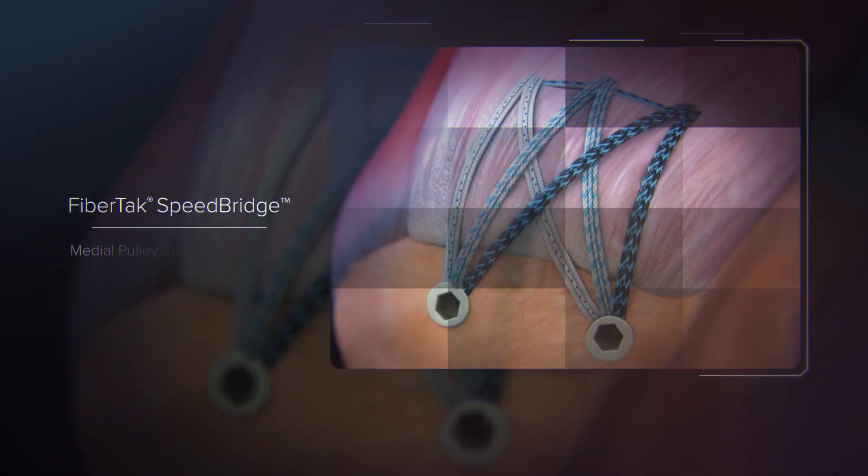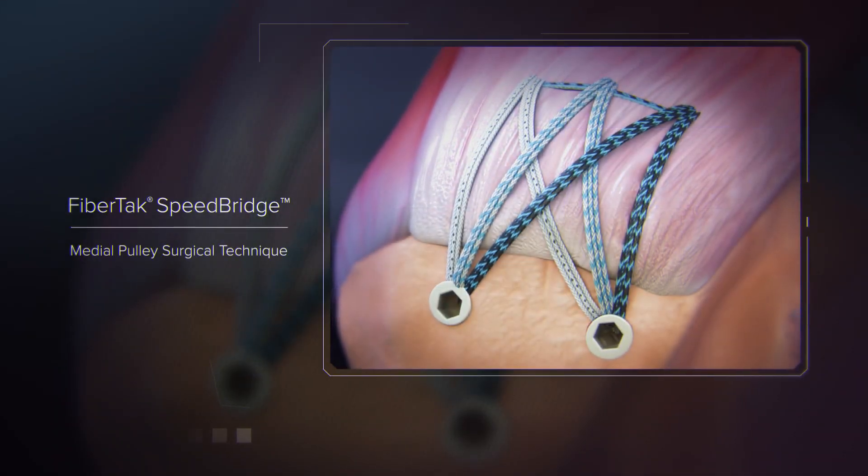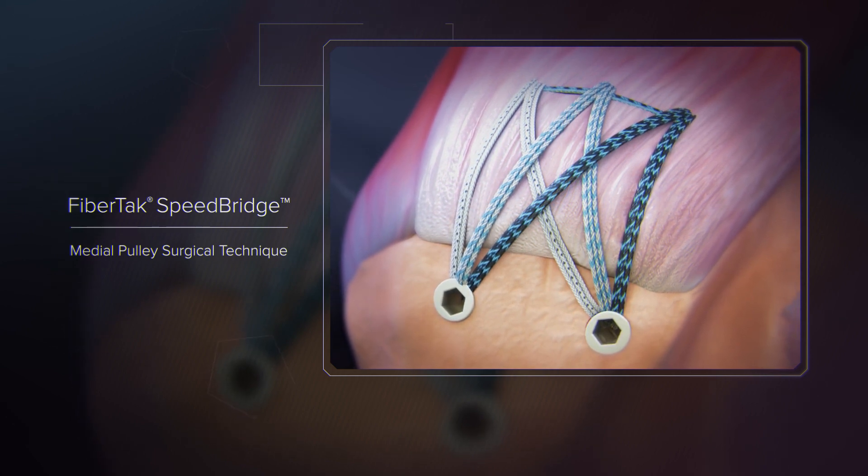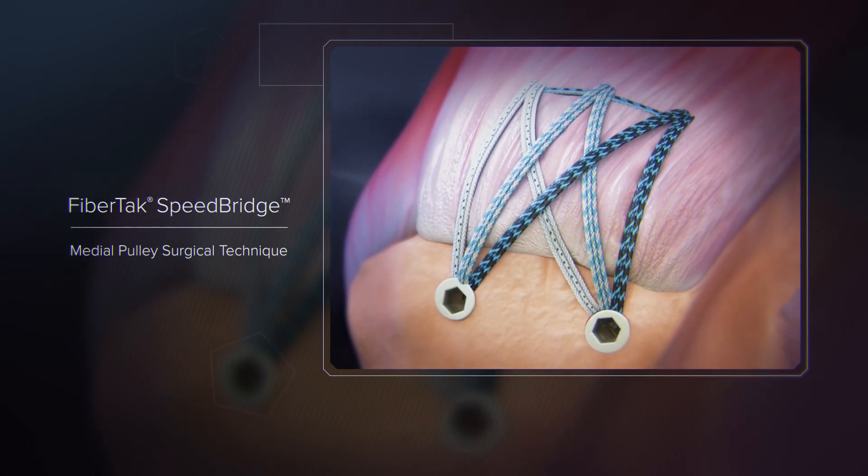The FibreTac speed bridge with a medial pulley ripstop uses the knotless 2.6 FibreTac RC anchor. This anchor is available with a tensionable knotless mechanism which can be interconnected, providing additional compression on the medial row of the FibreTac speed bridge.